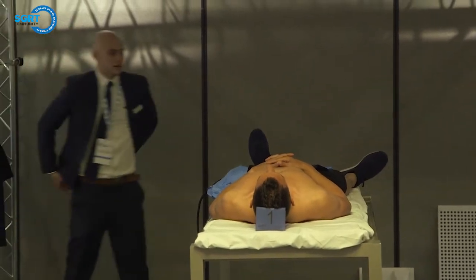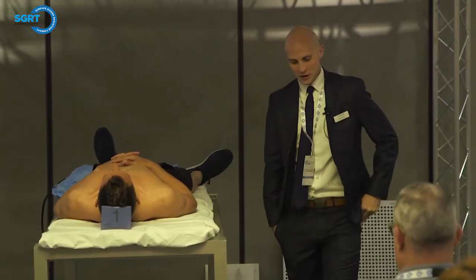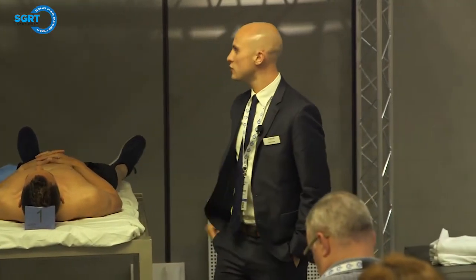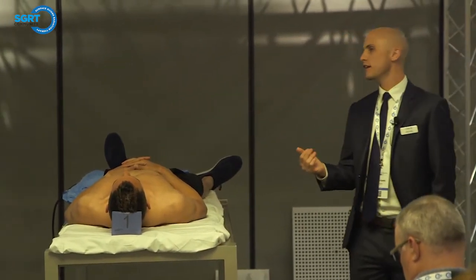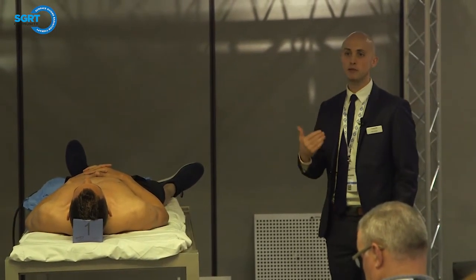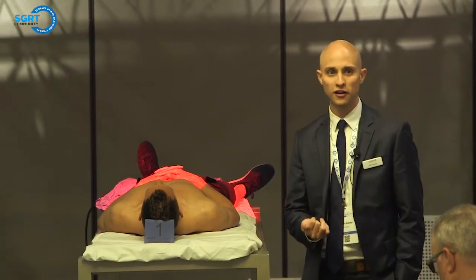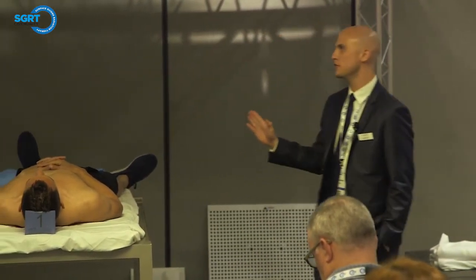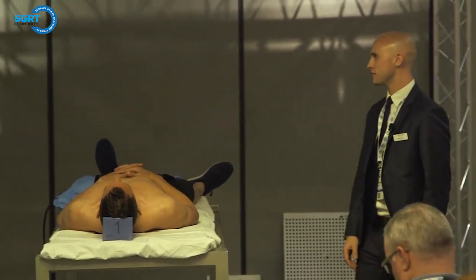Okay. All right, so here are the rules. Ready? Go. Okay, so we're going to set up this extremity, again just using rotation, roll, and pitch. I'm going to do it first, and see how long it takes me, and then we're going to ask a couple volunteers to come up and see if you can beat me. There are a couple Starbucks gift cards involved in this, so it's really fun. We just need a couple volunteers, so just be thinking about it. We're here to help you too, but it is very simple how we set this up.